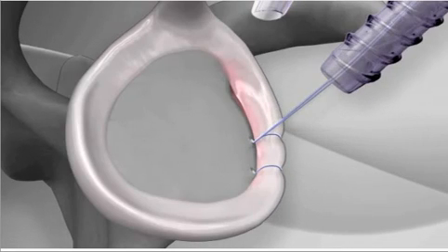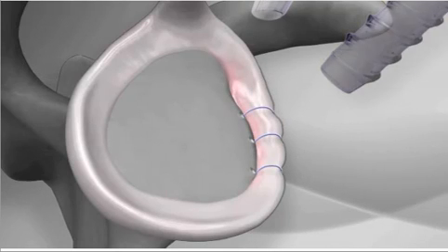Typically, a surgeon will use 3 anchors for a cartilage repair.